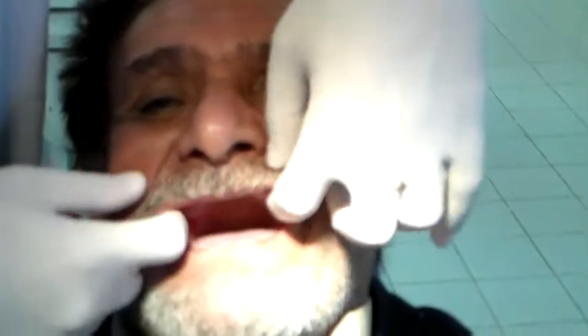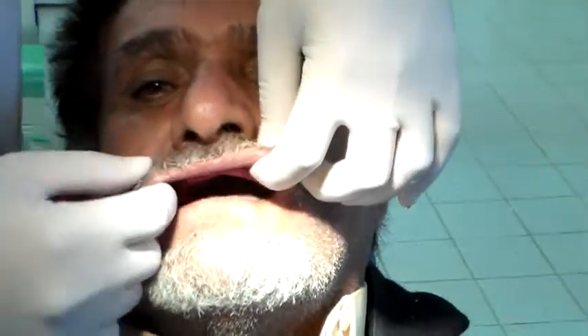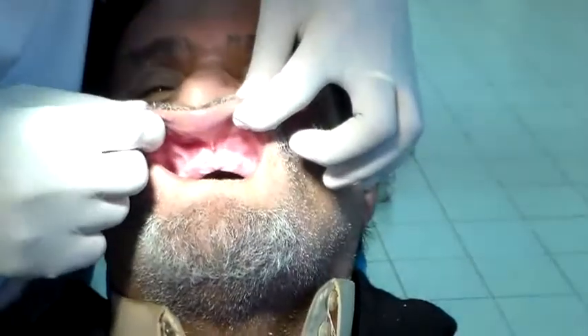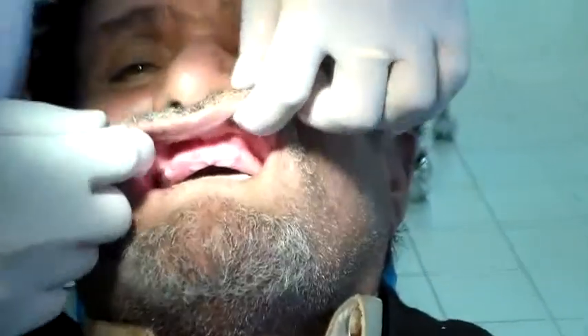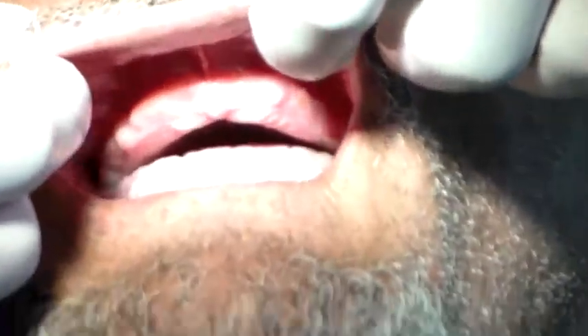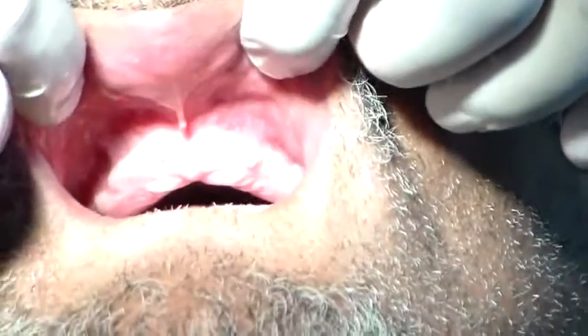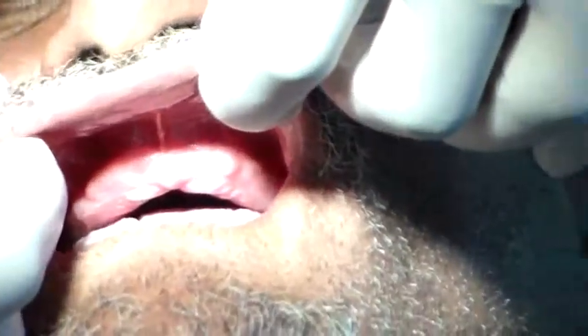Once this is placed, let me just show you this. I'm going to angle it a little bit and correct the light. When you check the vestibule for examination, you can lift up the lip like this. But when you're checking for vestibule depth, you need to look at it with the lip out because the patient can at best move it out. He can never flare it up like that. So you can check it like this.